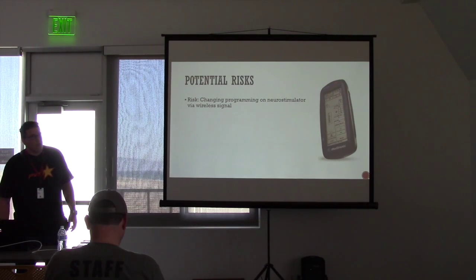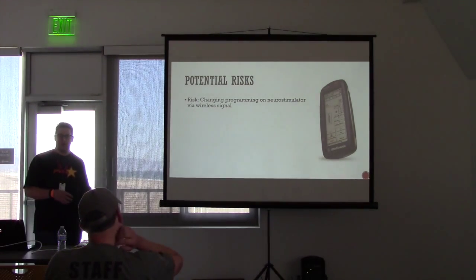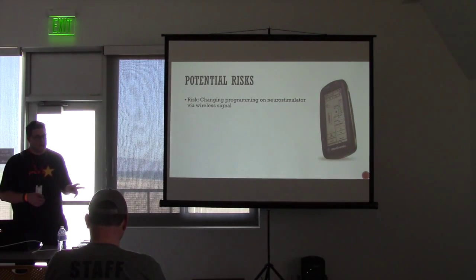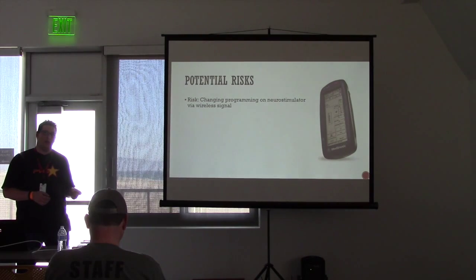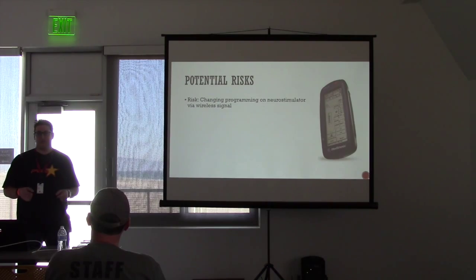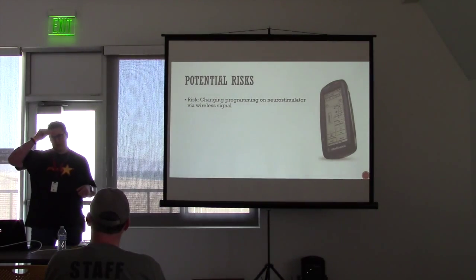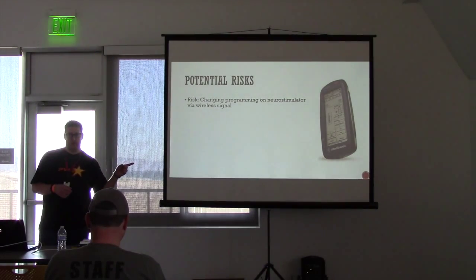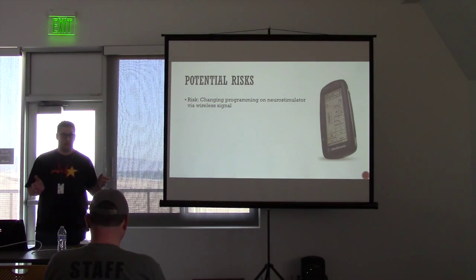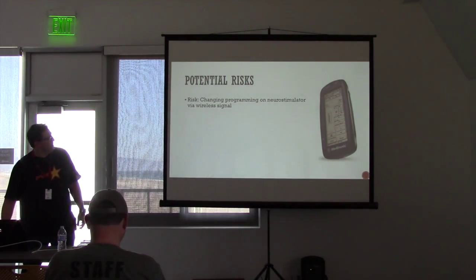So Dell had this interesting threat model on medical devices. Their only comment on these kinds of devices was that someone could change the stimulation profile, causing a user to be in more pain and thereby use more medication, which could potentially get them to overdose. It was the dumbest threat model I'd ever seen in my entire life. They were saying basically you could walk up to someone, reprogram them, and over time they would use more medication and potentially overdose. And that was their threat. Sure, that seems like a very reasonable threat.